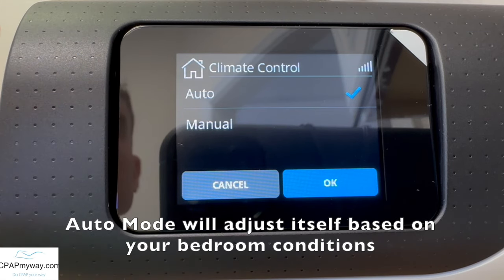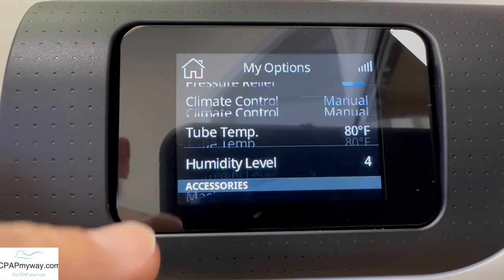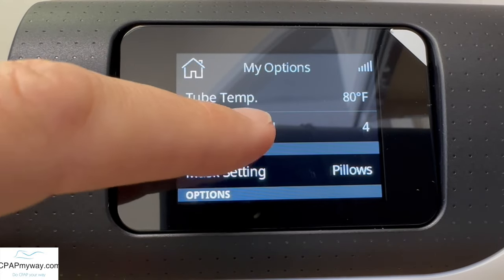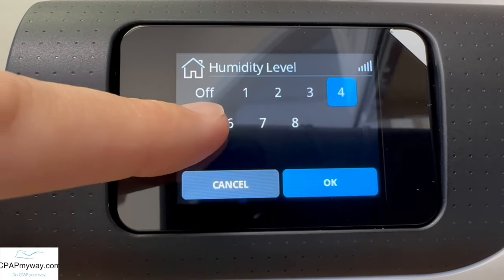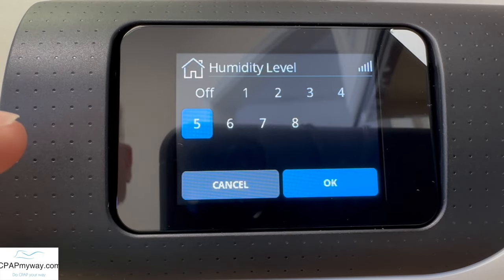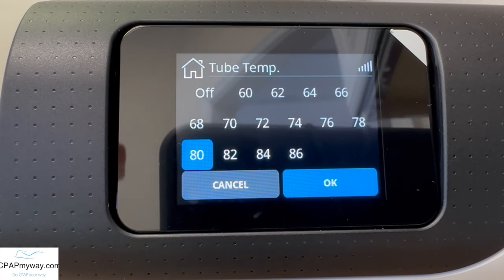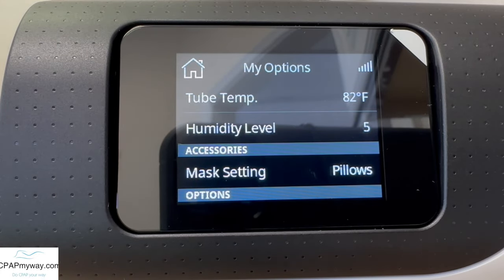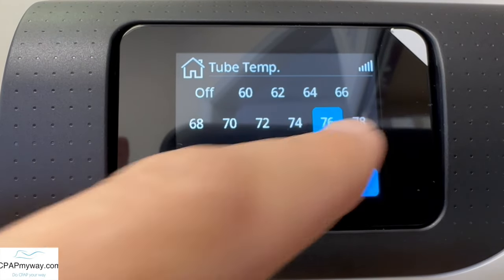I really recommend most people start in auto. If you can let the machine work for you, that's great, especially if it's doing a good job. But if you're not getting the results you want in auto mode, you can click manual and hit OK. That'll allow you to adjust both the tube temperature and the humidity level. Humidity level you can go as low as off or as high as eight. If you need more humidity, increase it — I recommend increasing one setting at a time so you don't overdo it. If you're noticing any rain out or excess condensation in the tube, you may want to increase your tube temp a little bit. Take changes down slowly, a setting or two at a time.